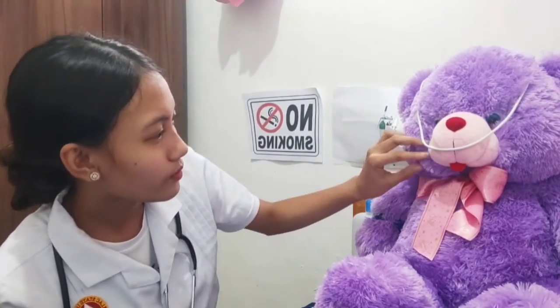After that, we assess the client regularly and assess the client's nares for excoriations and irritations, providing a water-soluble lubricant as required to soothe the mucous membrane. We also assess the tops of the client's ears for signs of irritation from the cannula tubing — if present, pad with gauze to relieve patient discomfort.